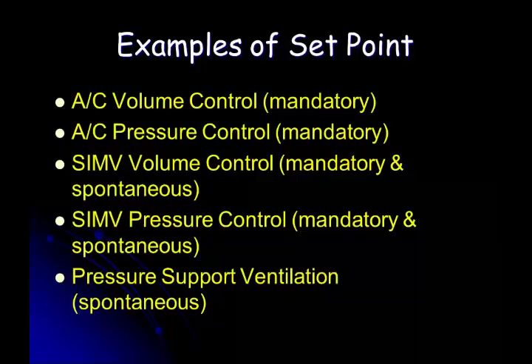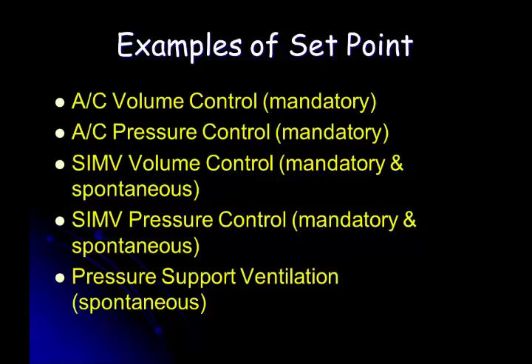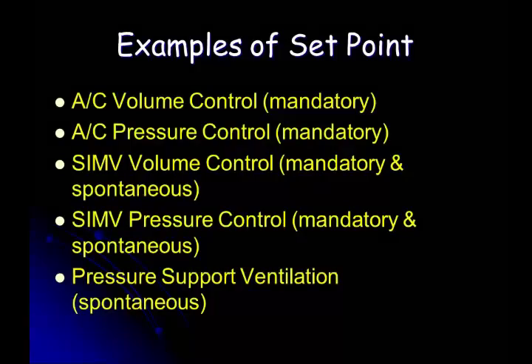Okay. So assist control, we good? Okay. I can do SIMV. SIMV, if you remember, is a combination of mandatory breaths and spontaneous breaths. With SIMV, I dictate how many mandatory or mechanical breaths they'll get in a minute's period of time, SIMV of 10. So every 6 seconds, the machine turns on, delivers a mandatory breath. It's synchronized so that it's not trying to deliver a breath while the patient's exhaling. It's kind of rude, right? So S stands for Synchronized.